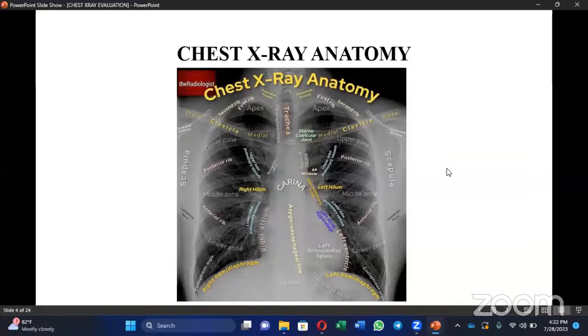However, on an AP film, because the AP film is mostly done on patients who cannot stand to do the standard chest X-ray examination, mostly the patient lies supine or the patient is sitting. So with that, the patient cannot rotate the arms to clear the scapulae off the lung fields. So mostly we have the scapulae overlying the lung area or the lung region. Okay, so I think basically these two structures that I've made mention of, that's the clavicle and the scapulae, should help you to differentiate between the AP and PA films.